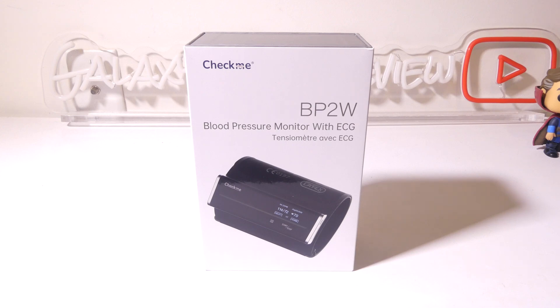Hey everybody, it's Luke over at Galaxy Tech Review, and today I've got a product from CheckMe. This is their model number BP2W, blood pressure monitor with ECG function. You can check your blood pressure and your ECG with the BP2W. It connects via Bluetooth to your device like your phone or your tablet, and also supports a Wi-Fi connection as well.